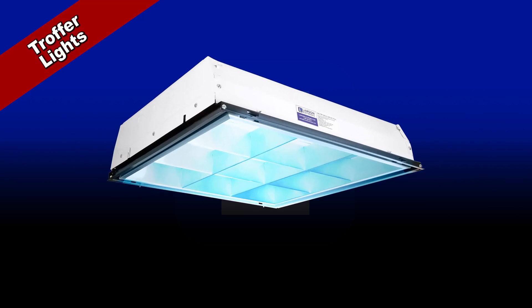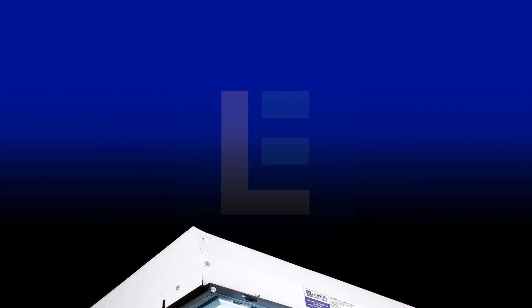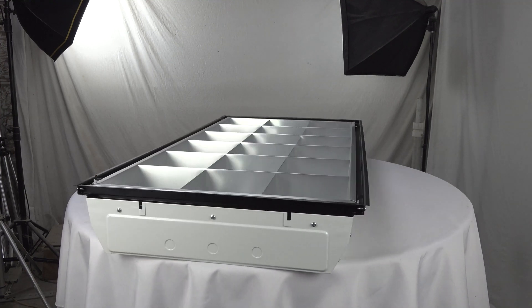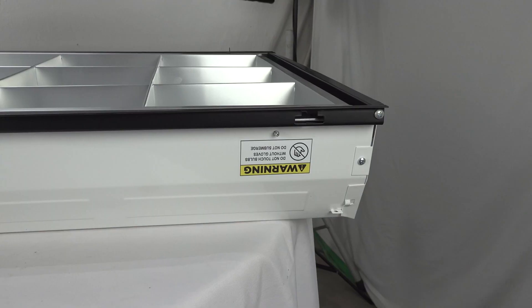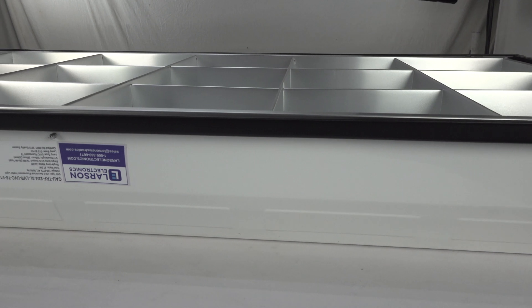UV troffer lights. Available in 2x2 and 2x4 sizes, this germicidal UVC recessed troffer mount fluorescent fixture offers high light output from a compact form factor. This troffer mount UVC germicidal fixture is for recessed mounting in inverted T-bar grid ceilings. This is a great lighting solution for general area lighting systems and commercial indoor spaces.